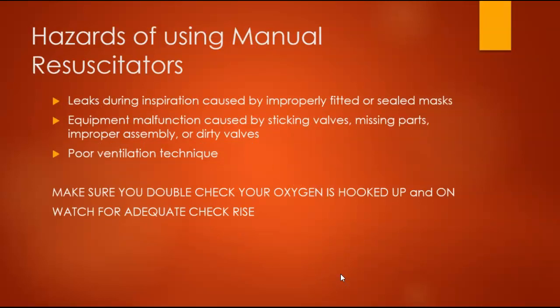Okay, so hazards of using manual resuscitators. Some things to just be aware of. Leaks can occur during inspiration if you don't have the mask fitted properly or sealed properly. And the equipment can malfunction. You can have sticky valves inside and malfunction.